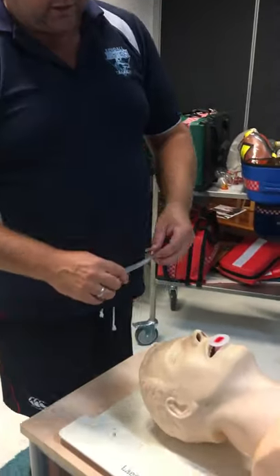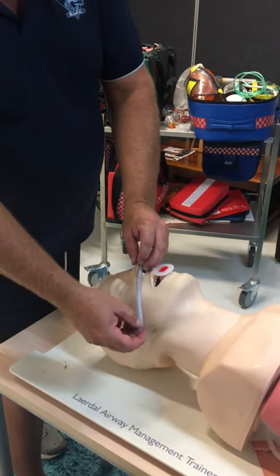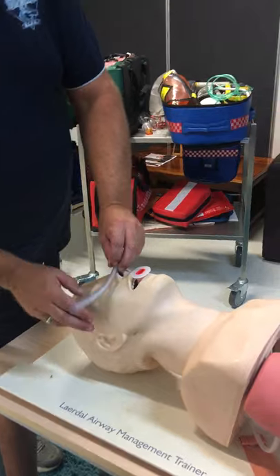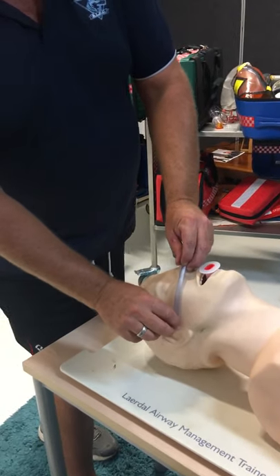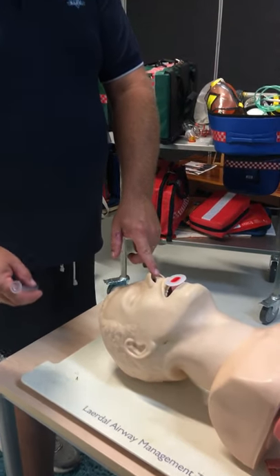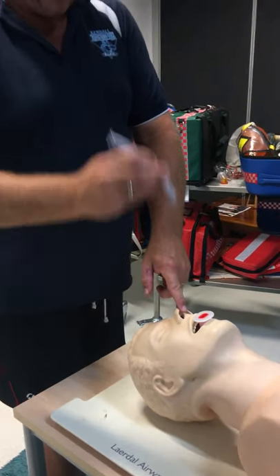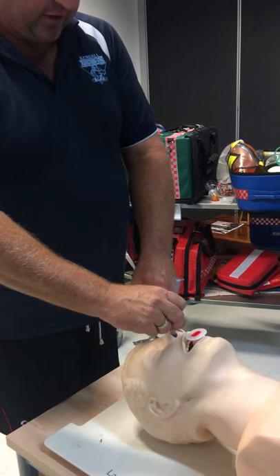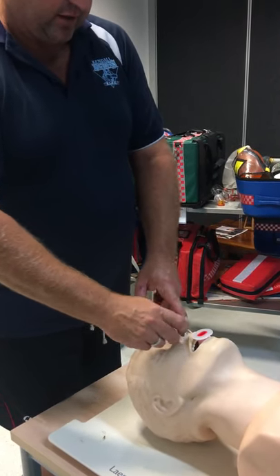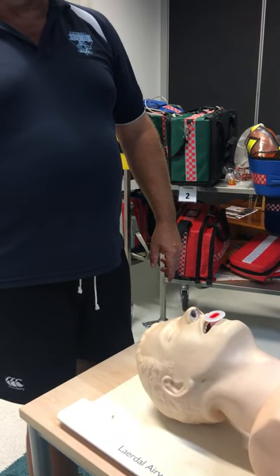NPAs — you measure from the center of the nose to the earlobe. Your right nostril is generally bigger than your left, so you go for that. Aim it straight down, push it in, twist twist twist, and it goes in.